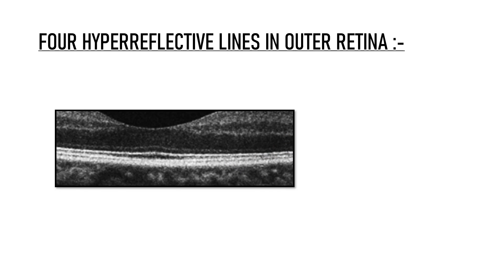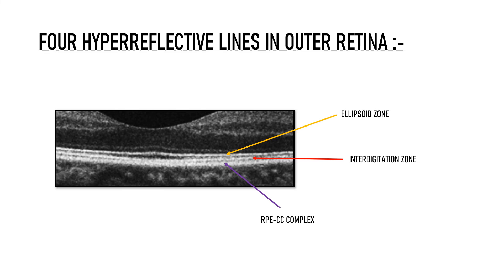Thus, four distinct hyper-reflective lines can be seen in the outer retinal layers of an OCT scan. From outside to inside, these are: RPE or retinal pigment epithelium, then the IZ or interdigitation zone, then the ellipsoid zone (EZ, or IS-OS junction), and the fourth line is the external limiting membrane.